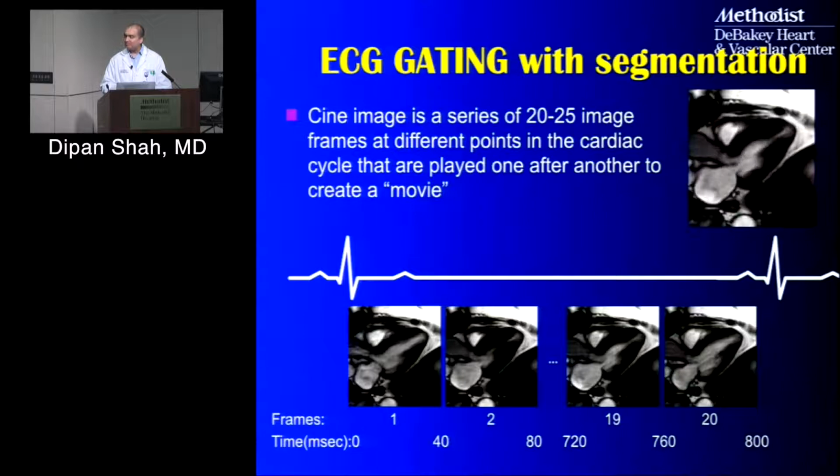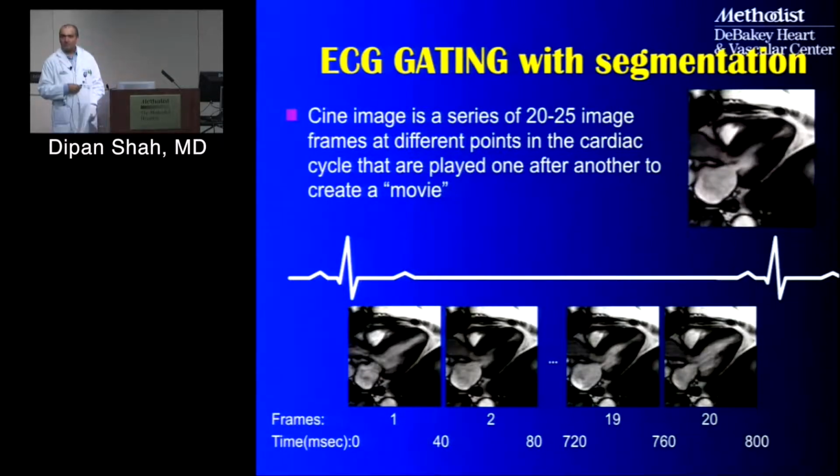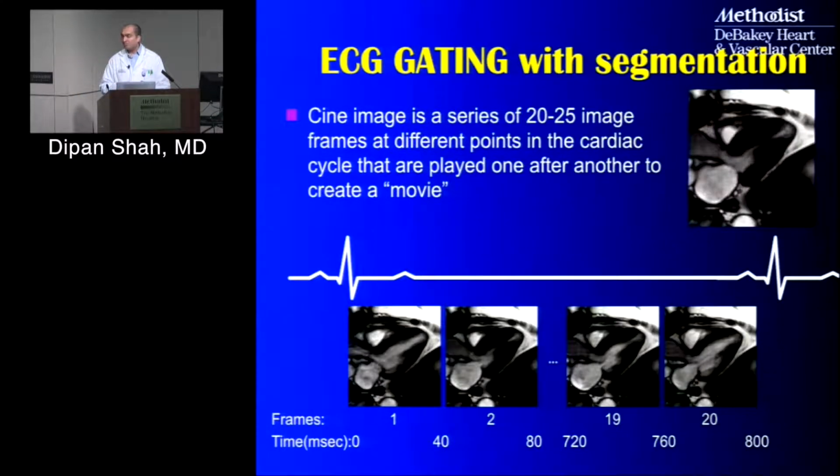Actually, it depends. We have abilities to record much higher than 100 frames per second. Right, if you reduce the depth. We can also change the width. We can also, some systems would allow you to go up on the frame rate. So it is something within our control. And it depends on what is the question that is asked. How fast are the events happening that I want to resolve?